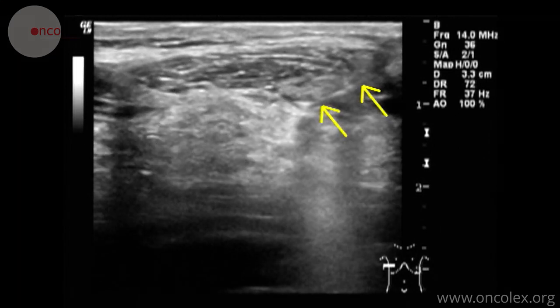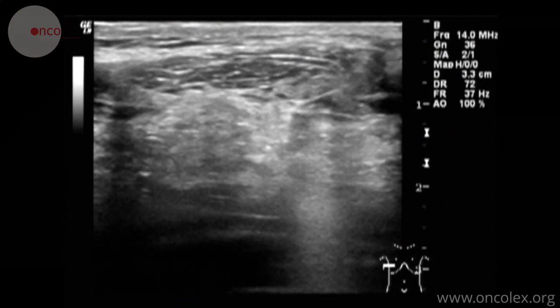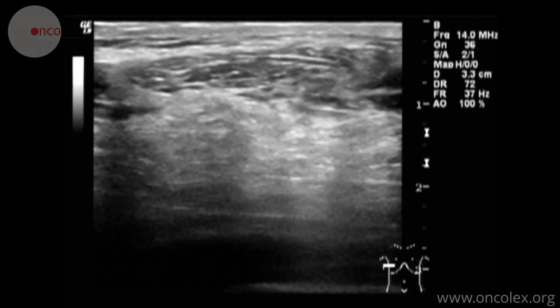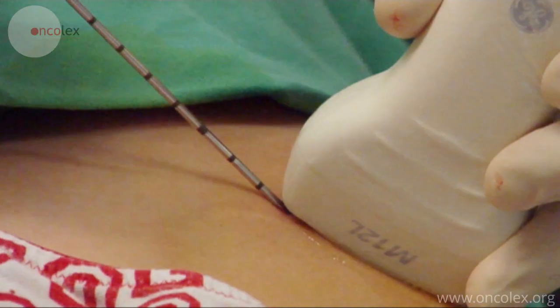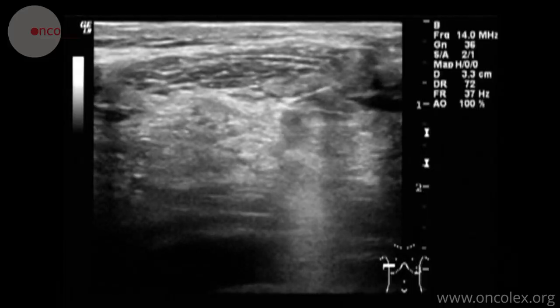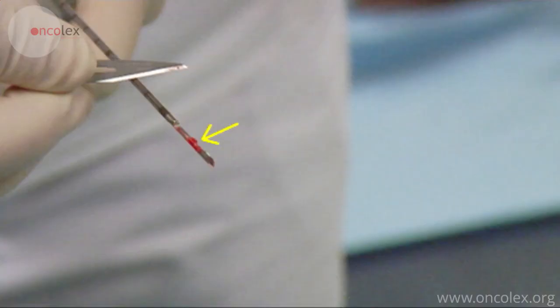Here we see the needle. When the biopsy gun is fired, the interior shaft of the needle is fired first, immediately followed by the exterior sleeve 22 mm into the tissue. The biopsy material is placed in an indentation in the interior shaft.